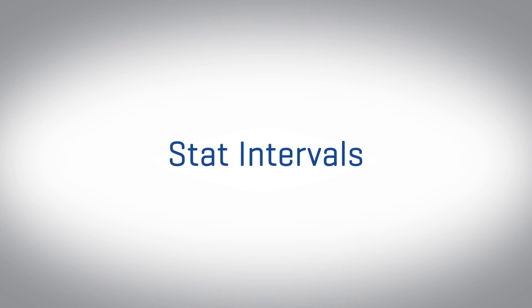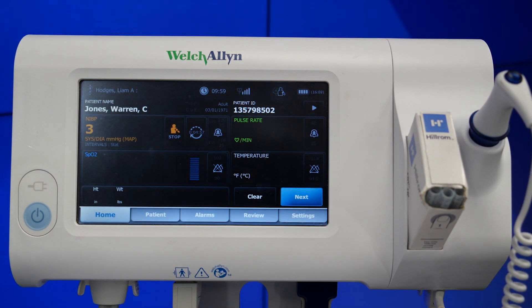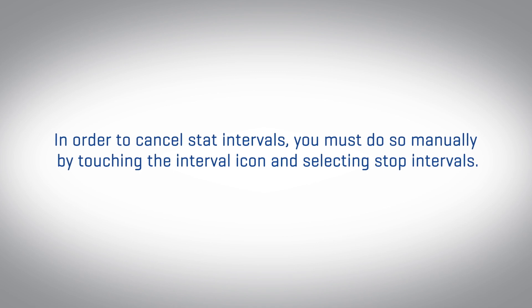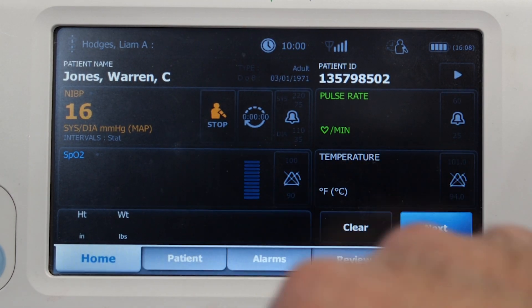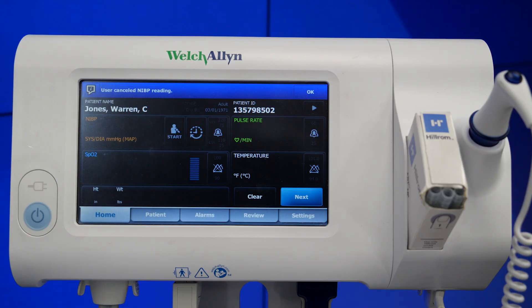Stat intervals is the third option. To select the stat option, touch the interval icon in the NIBP frame, then select STAT. The monitor takes repeated NIBP measurements for 5 minutes, starting a new cycle each time the cuff deflates below safe venous return pressure for 2 seconds. In order to cancel stat intervals, you must do so manually by touching the interval icon and selecting stop intervals. If you would like to stop only one measurement, touch the stop icon in the BP frame. This will cancel an actively inflating cuff but will not affect future interval measurements.